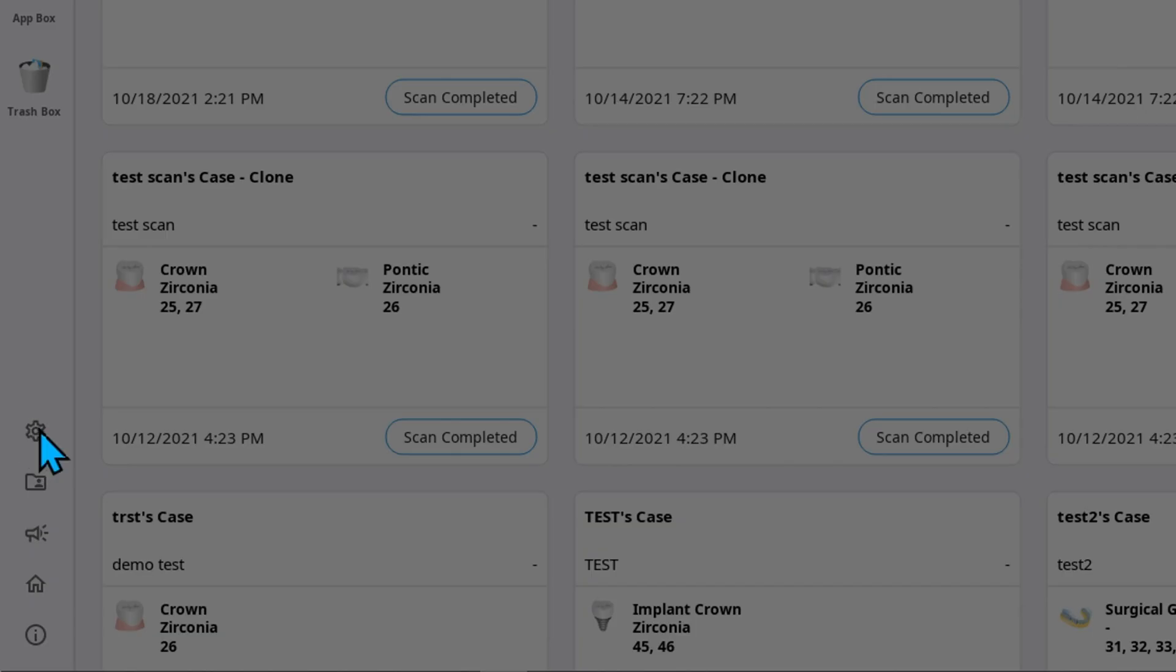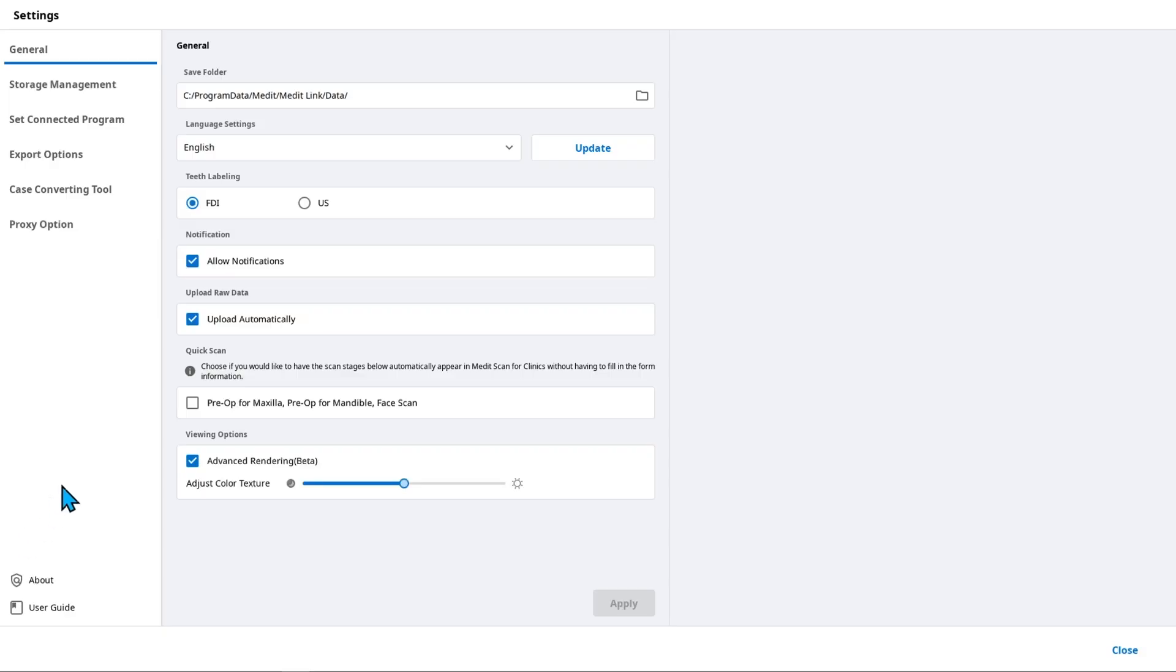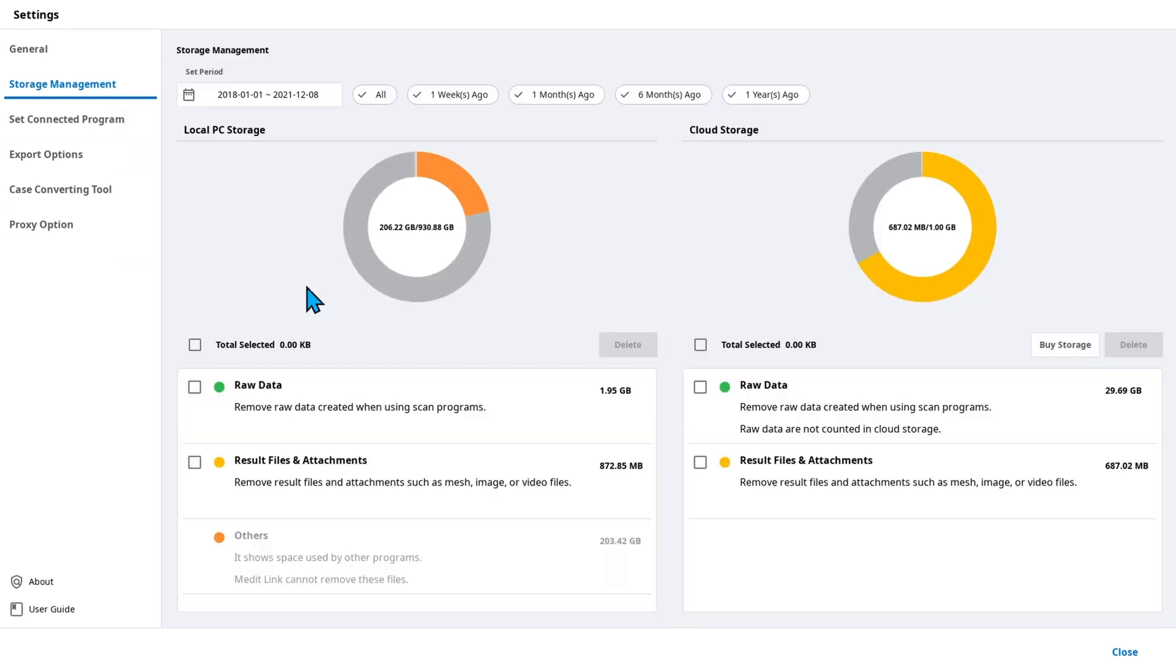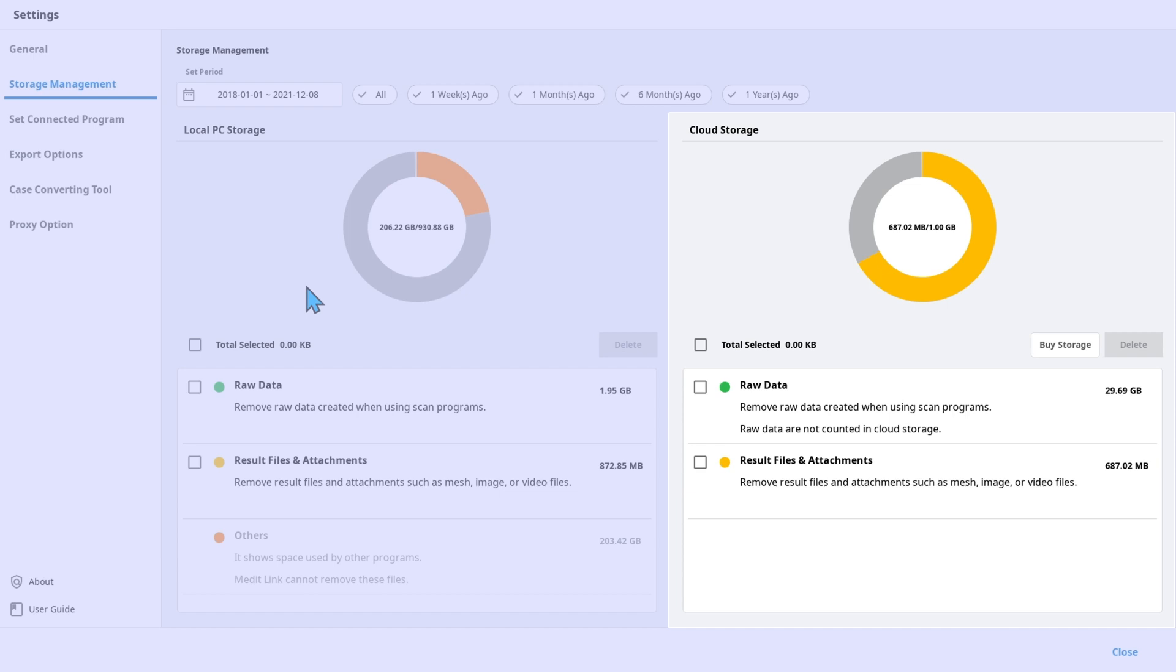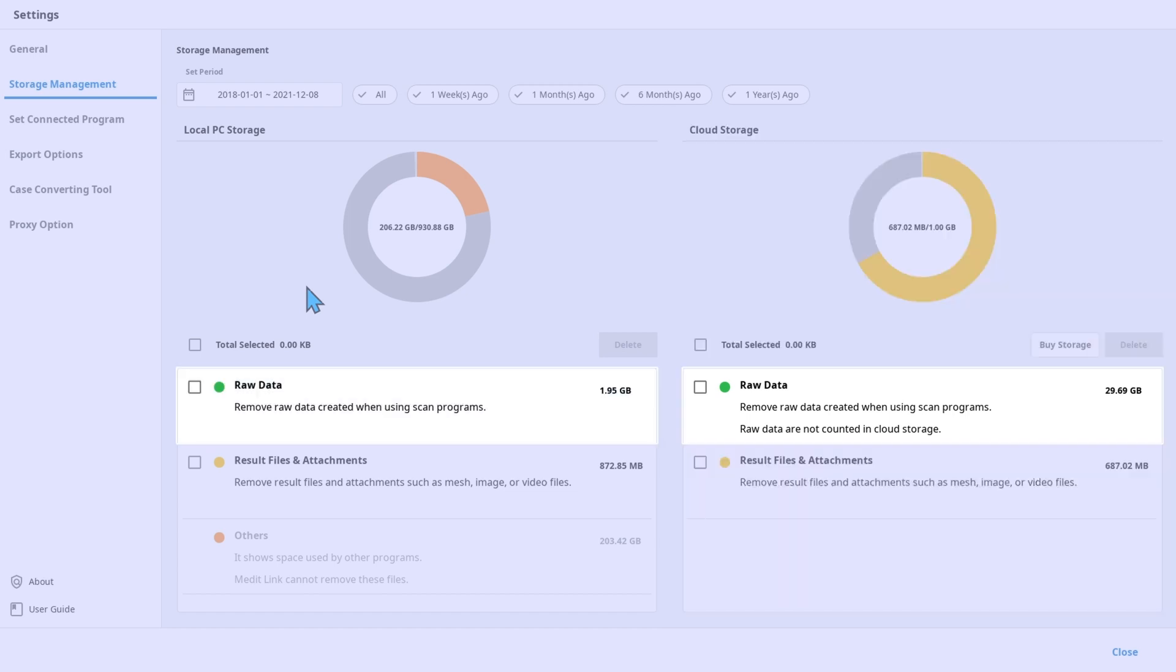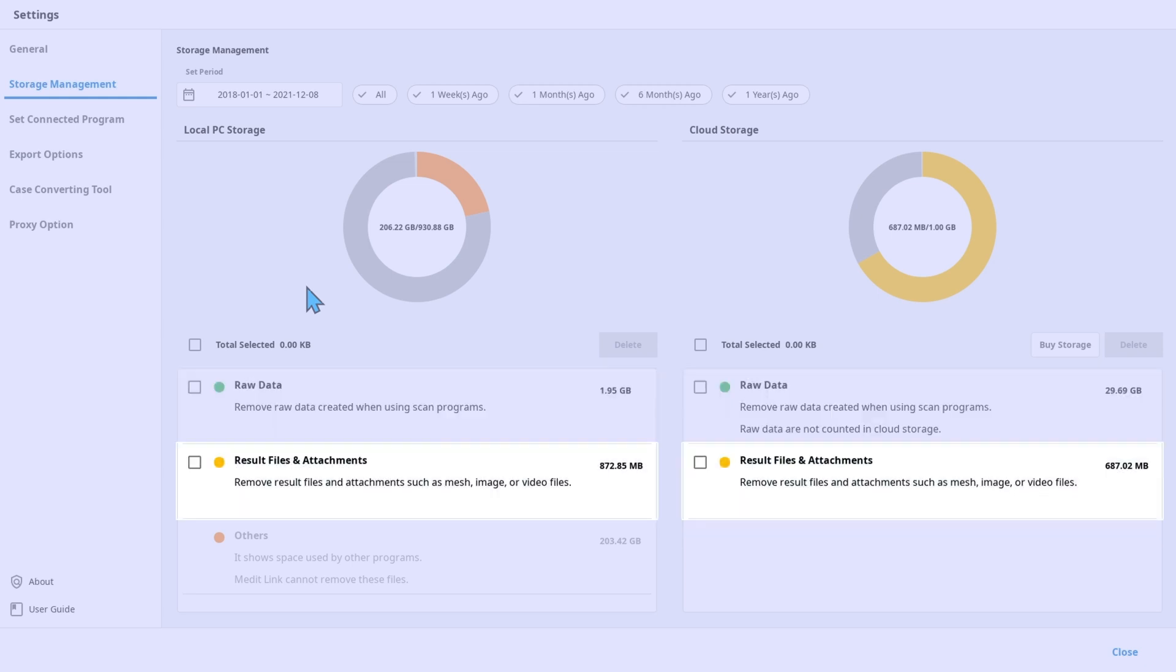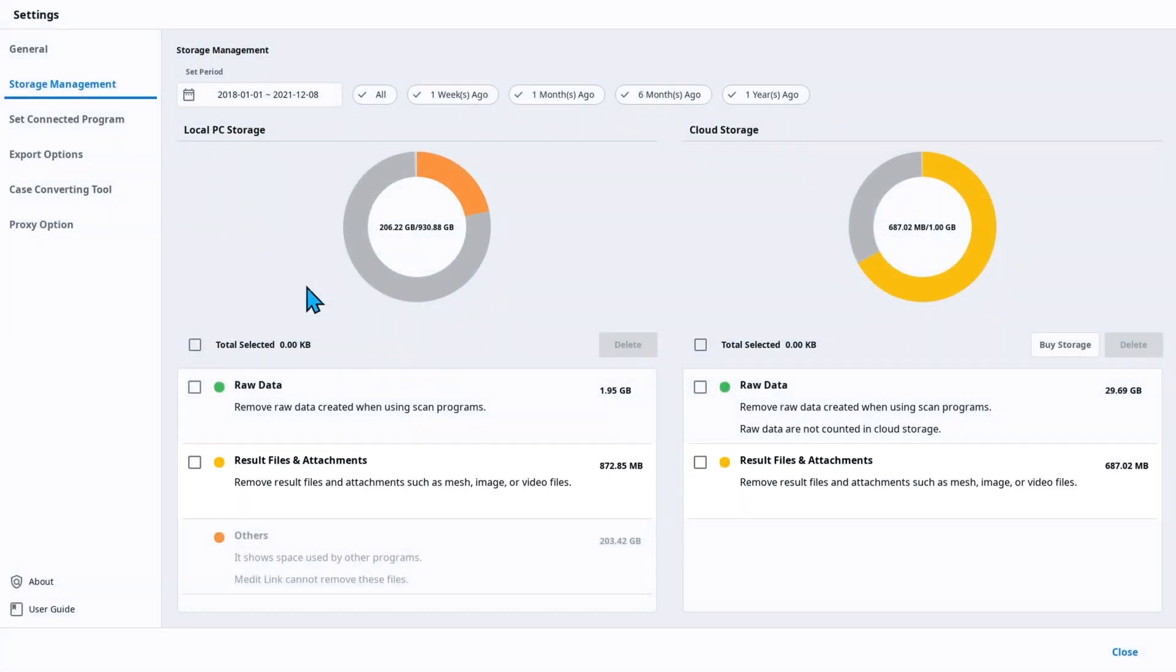Another method to manage your storage space is to delete files in bulk using the storage management section in the settings. In this section, you can check local and cloud storage capacity side by side. In the list below each storage chart, you can see how much space is taken by the raw data and the result files.